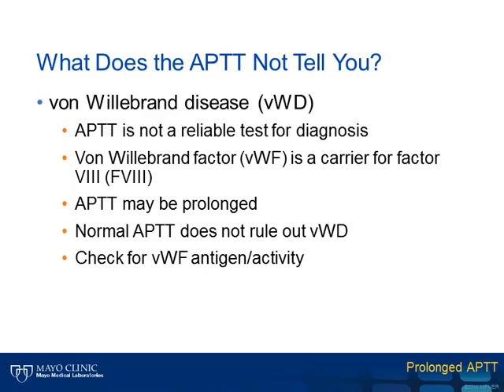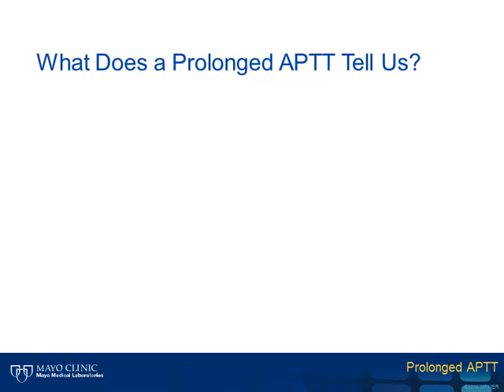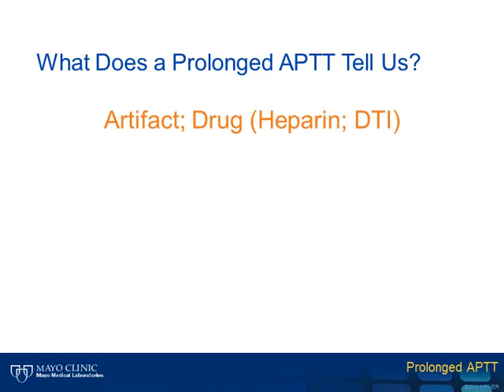It is important to note that the APTT assay does not consistently provide useful information on presence or absence of von Willebrand disease. Since von Willebrand factor is a carrier protein for factor VIII, a deficiency of von Willebrand factor will result in a lower factor VIII, but the degree of deficiency may not result in a prolongation of the APTT. Thus, to exclude von Willebrand disease, which is the most common congenital bleeding disorder, one should check von Willebrand factor levels.